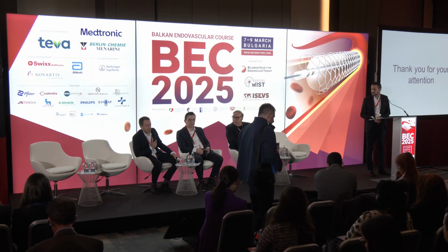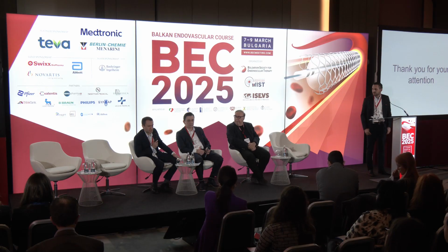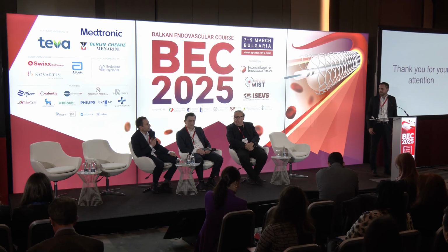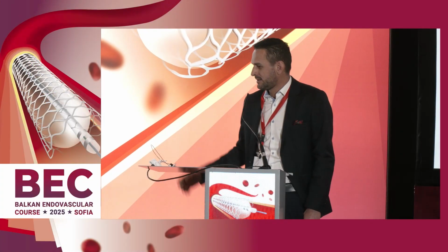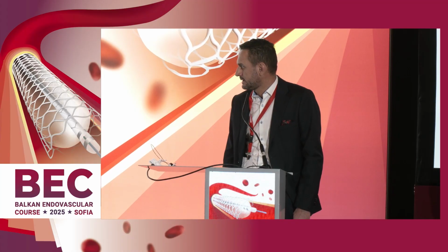Very good result. Can I ask you how many of your tibial accesses are sheathless, and are they additional access or primary access? Maybe 20% primary access. 20% primary and 80% additional. You have proximal femoral, brachial, or whatever access. Yes. Okay, thank you. Still 20%, but I think that in time it can be 50 or 40%.